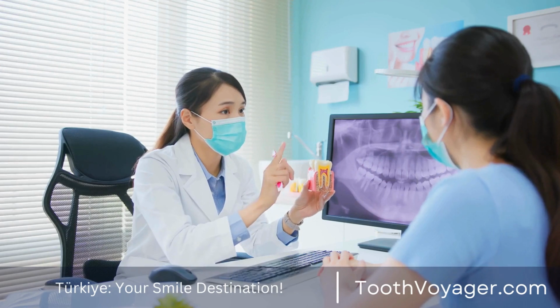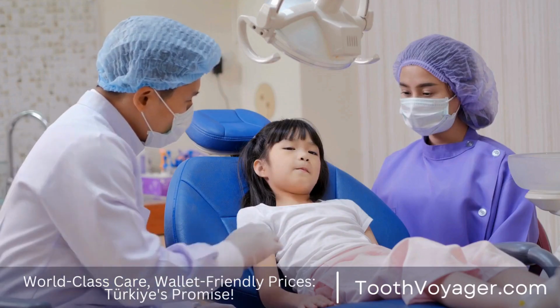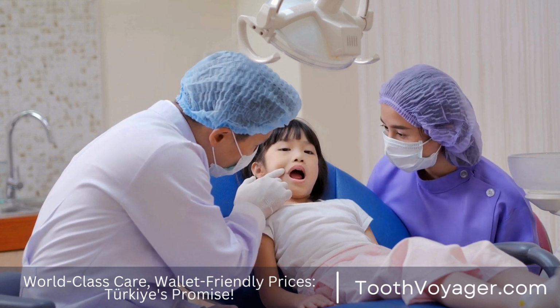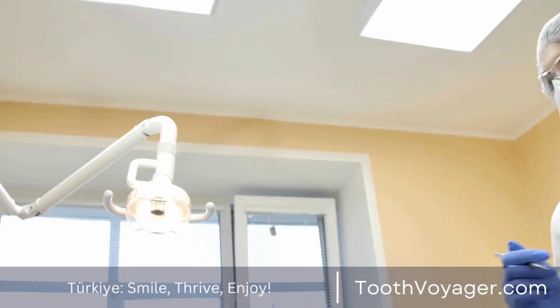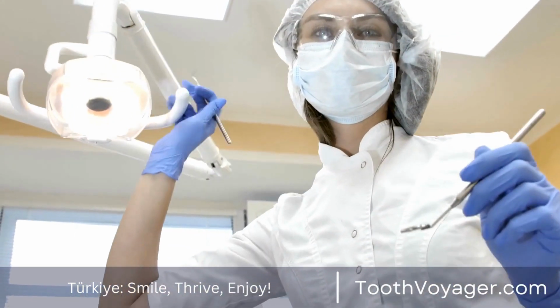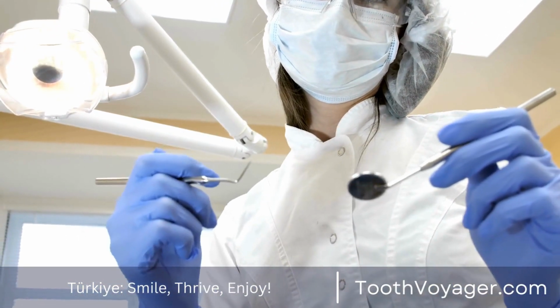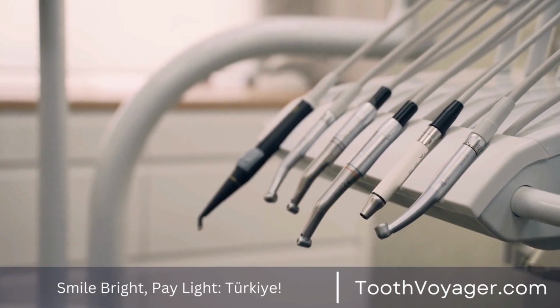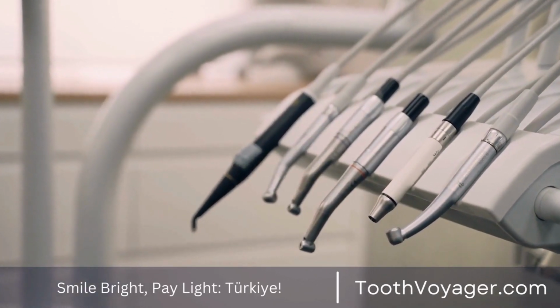What is a dental bridge? Dental bridges are the most common procedure in dentistry that replaces any missing teeth within a patient's mouth. It is composed of a number of crowns, which are fixed to the teeth on each side of the gap where the tooth or teeth were previously missing. They act as anchors for the new tooth or teeth which will cover the space.